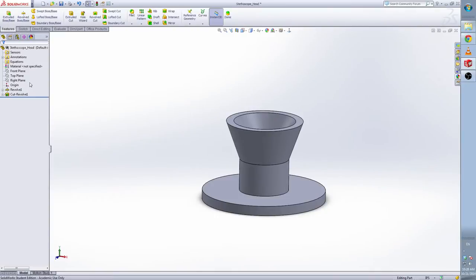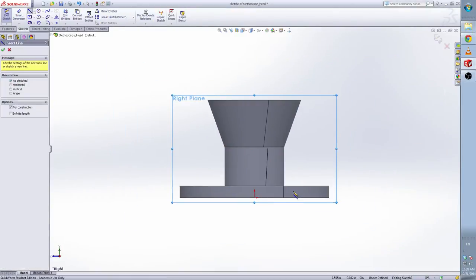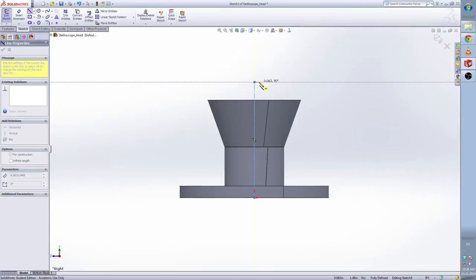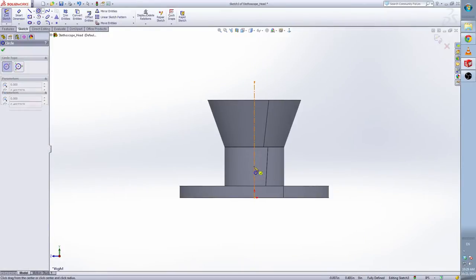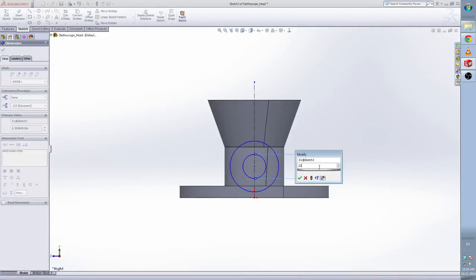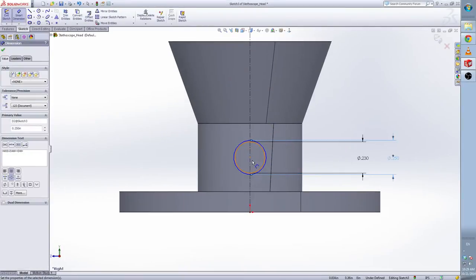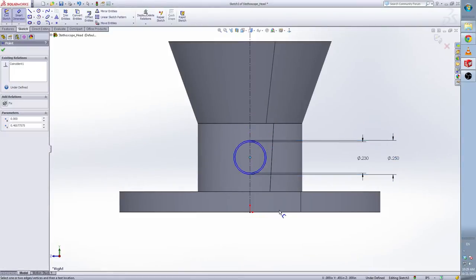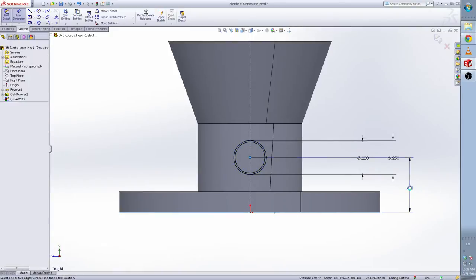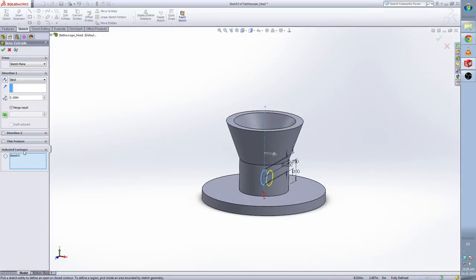Now I need to do the other extrude base from the right plane. We need a center line again — draw a center line first. Two circles with the same center point. Give them the dimension: the smaller one is 0.23, the bigger one is 0.25. The center to the base is 0.35. Now from here we clear this and we are going to select by ourselves.